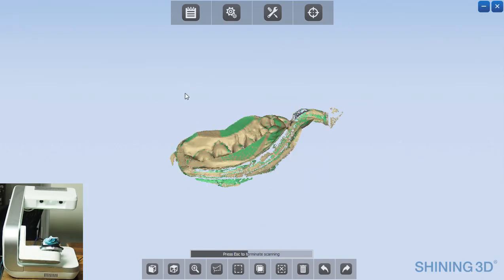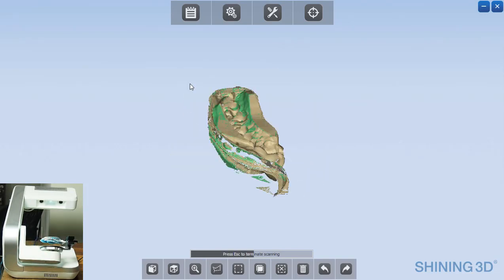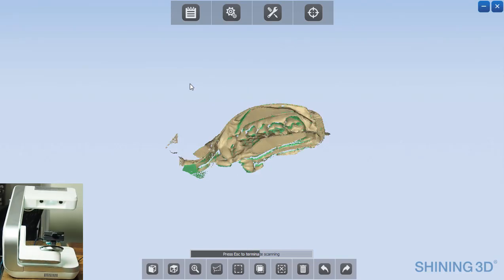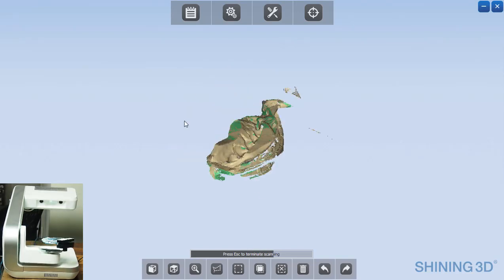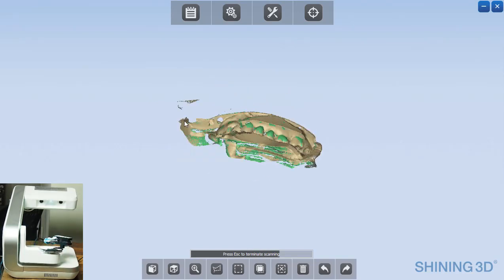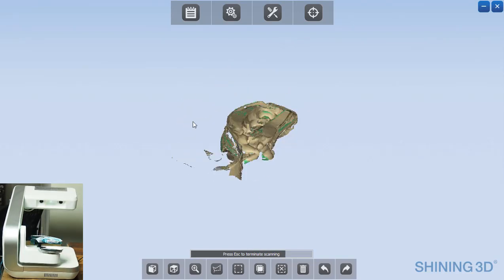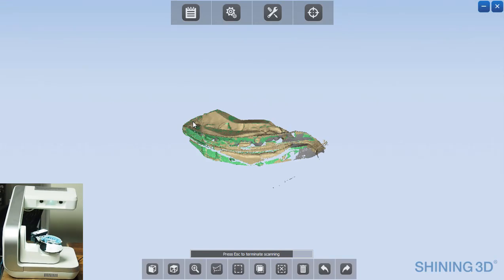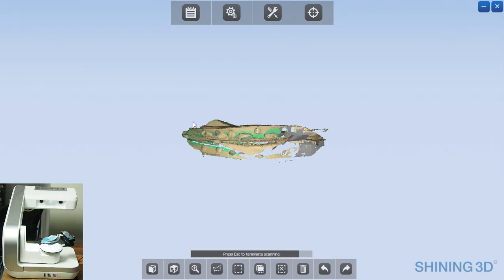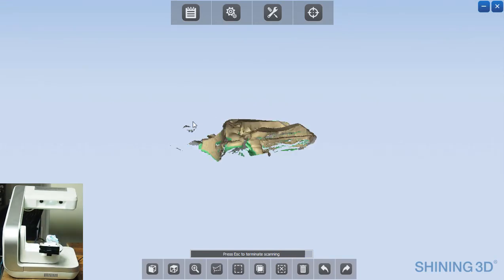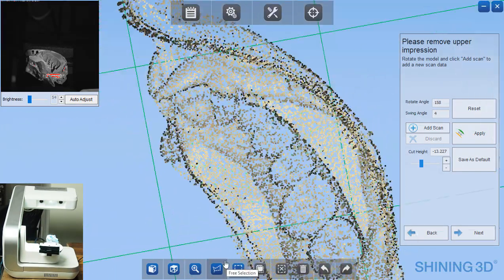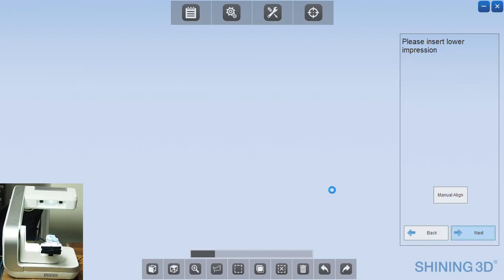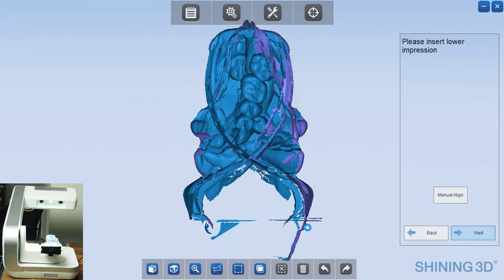As you can see here, it's running through, it's capturing all of these images. And now you see that that's complete. Didn't need to add any scan data on that one. So click next.